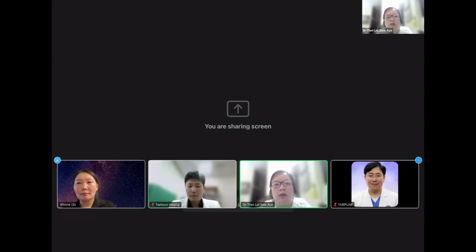So it might be difficult to make the diagnosis in the EP lab, and you are doing quite many maneuvers to confirm the SVT as well, and this is very interesting. So I'll open the floor for discussion from the audience and from the EP specialists from the Yonsei lab and Professor Changwan as well.